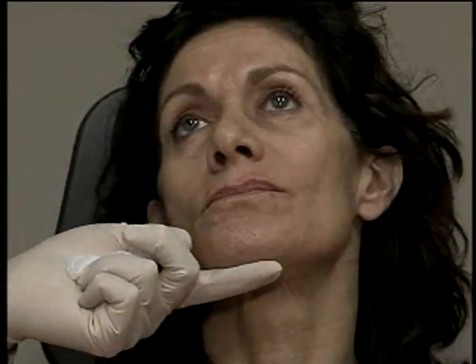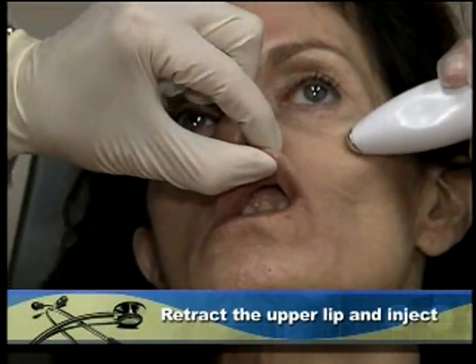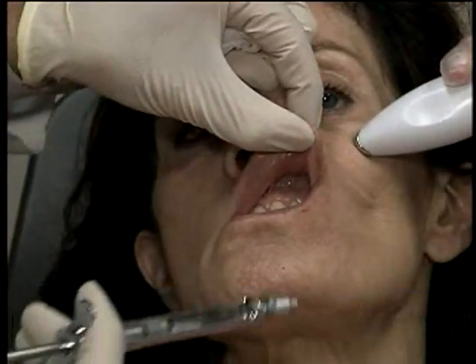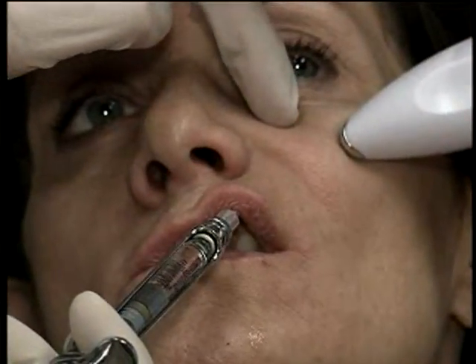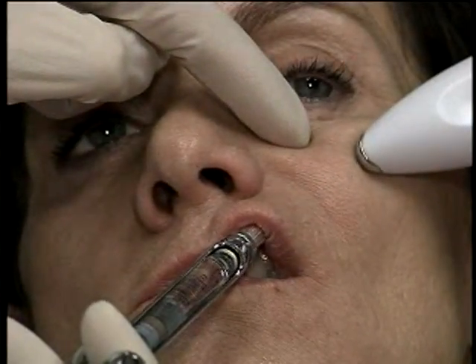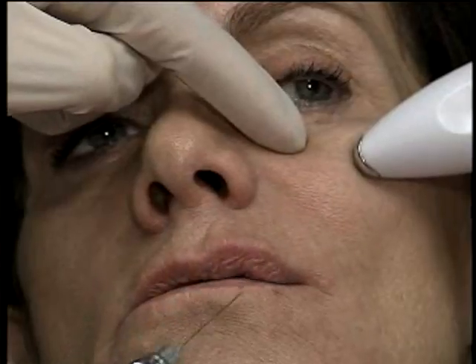There's two different ways of doing this, and I'm going to show you both ways. I retract the upper lip, and I place the distraction device onto the cheek. Now it's actually sitting down on the zygomatic arch. It's vibrating the bone. And I'm injecting, I go up into the canine fossa, and I'm shooting for right there. That's where I'm aiming for. So my needle is now on the bone, and there's the foramen, and I'm just below it. I'm going to inject about 0.25 cc's. And that's it. That should anesthetize the whole upper lip.